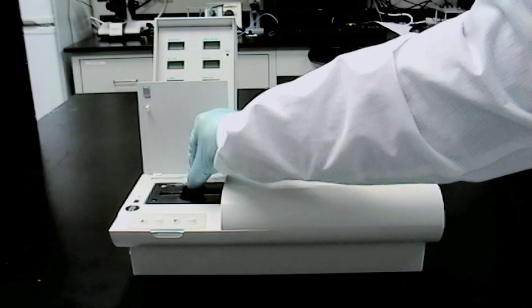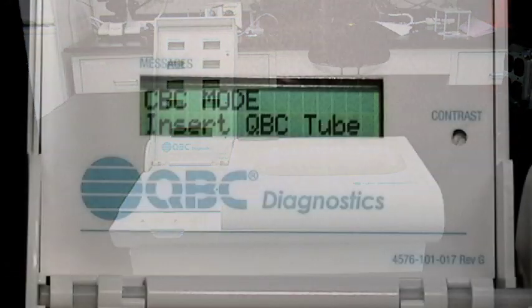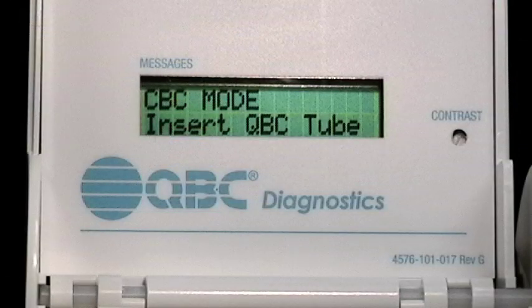Once the centrifugation is complete, place your tube in the QVC AutoRead Plus, making sure that the AutoRead Plus is in CBC mode, not control mode.